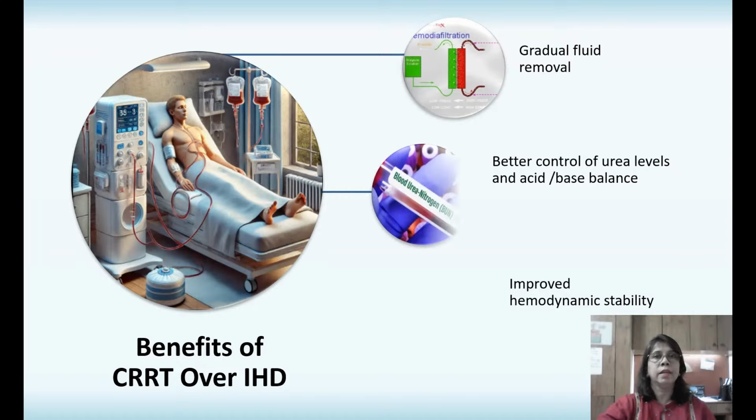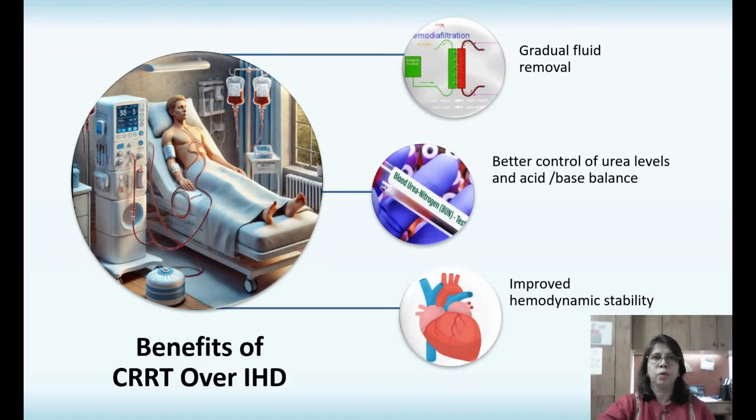In CRRT, there is a very gradual removal of solutes and fluids. And although large volumes of fluid and solutes are shifted, patients with hemodynamic instability fare well with CRRT. In CRRT, there is also gradual removal of urea, and acid-base balances are better stabilized.